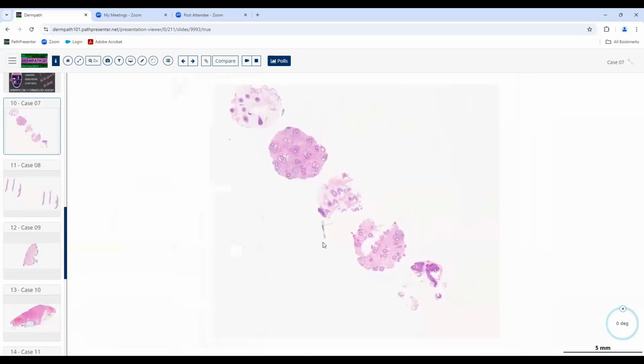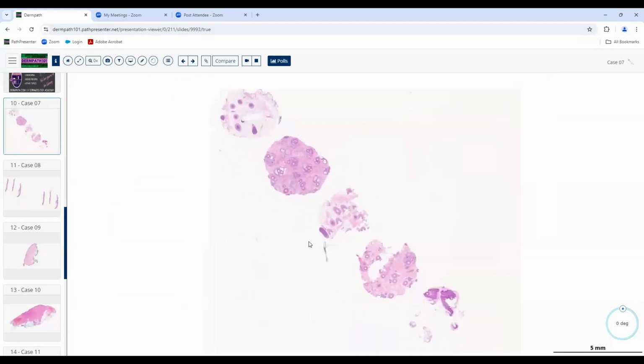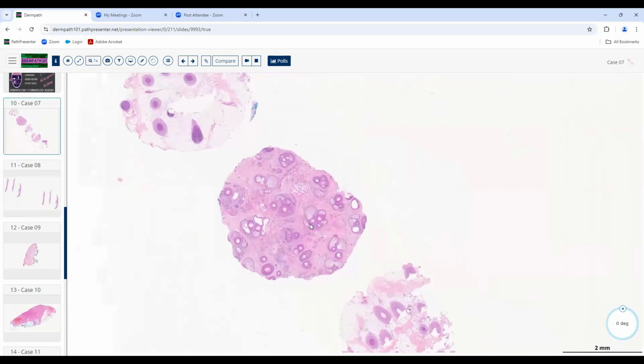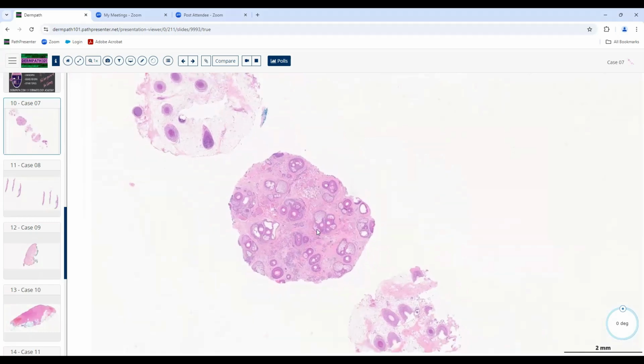Okay, here we've got a biopsy taken, and usually when we get a biopsy of alopecia, we get both a horizontal and a vertical. So they're probably not going to show you this with only a vertical or horizontal section like this. They're going to show you both the horizontal and the vertical section if they're going to show it to you. But here we've got an alopecia. And the nice thing about these sections, just to kind of educate you a little bit about that.